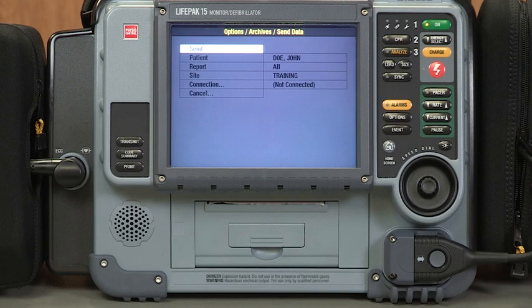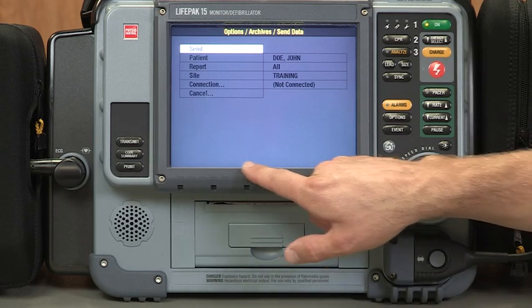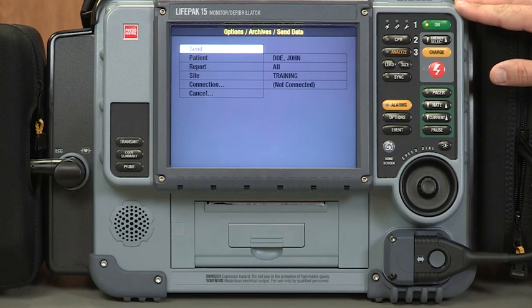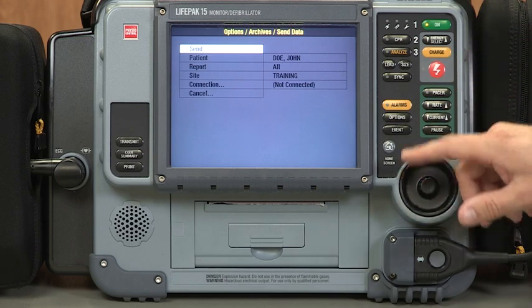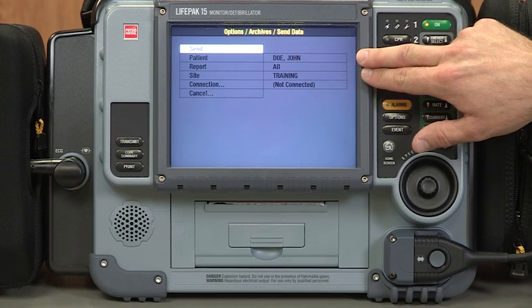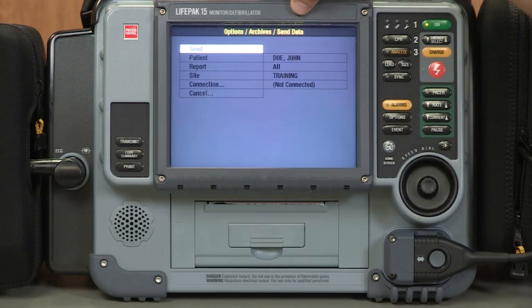If your event does not go through for some reason, you do not receive a transmission complete report, or it just hangs on that 99% transmitted, the machine, after a period of a minute or so, will reattempt a transmission. After that second transmission, if the machine hangs up or fails to transmit the event, we'd like you to shut the machine off, turn it back on, and go through the procedures of resending that event. Your patient will be saved in there as you've already saved it under John Doe. So you just have to get to the options, archives, and send data screen at that point and resend John Doe. You won't have to enter all the patient information again.